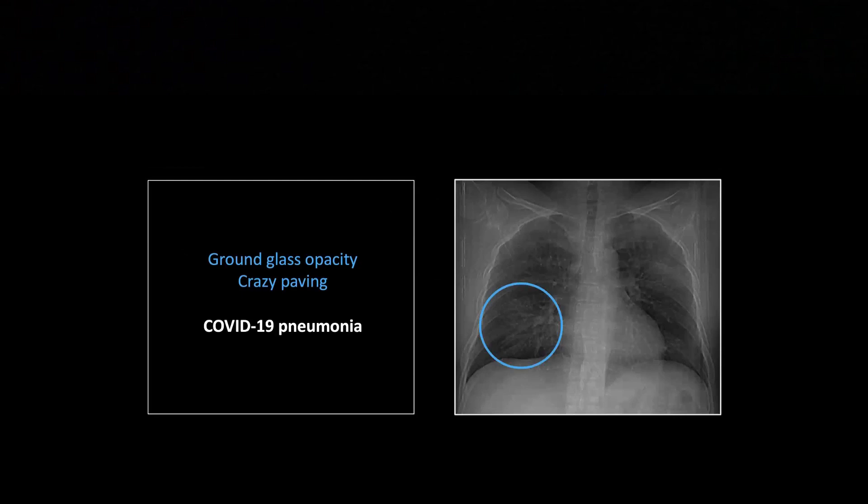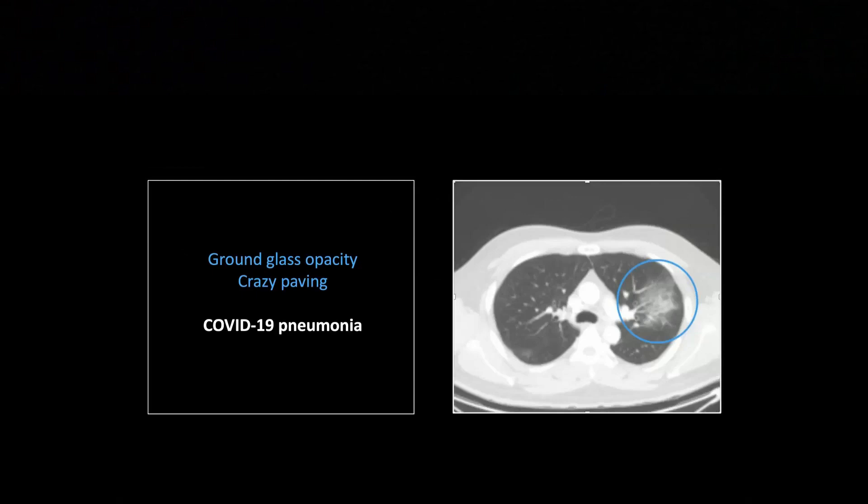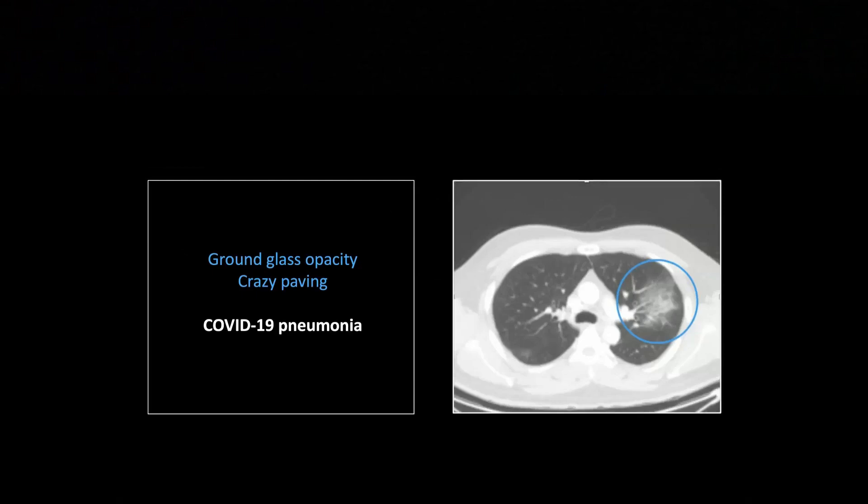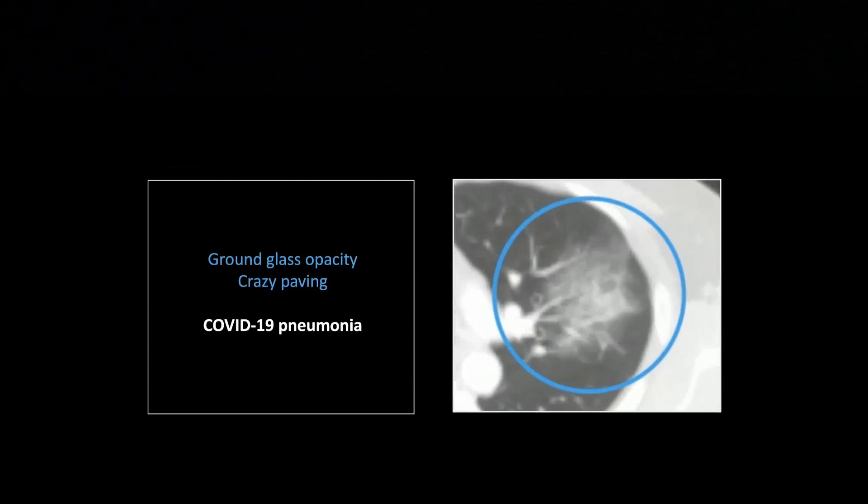There are very ill-defined foci of consolidation or density in both the left upper and right middle or lower lobes. Here is the CT. The reason we have this is to demonstrate the actual findings. This is a mixture of ground glass density and crazy paving, the two classic CT findings that were initially described with COVID.